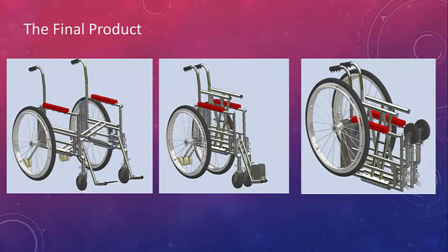on the chair. It also features removable leg rests via quick release pins located underneath the seat of the chair. In addition, the anti-tip wheels located in the back of the chair are adjustable and removable with spring button releases. My design also features Quickie 24-inch complete wheels with pneumatic tires. These wheels are held in place by a 4 3/4-inch long stainless steel button quick release pin.